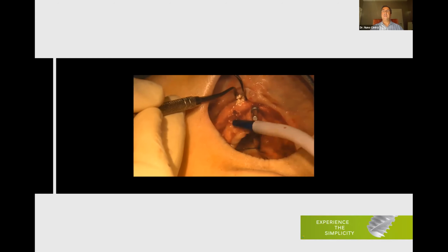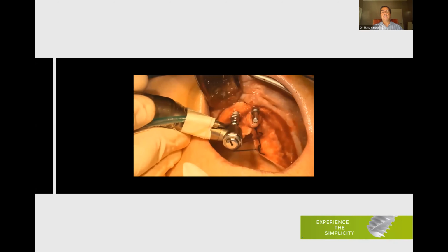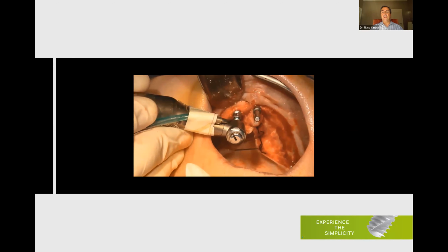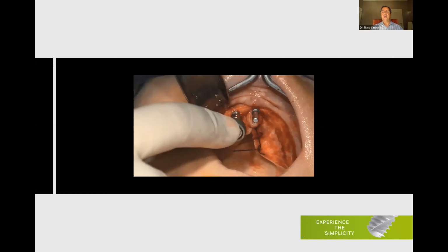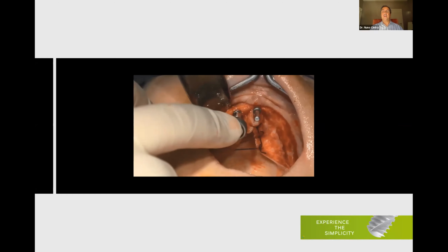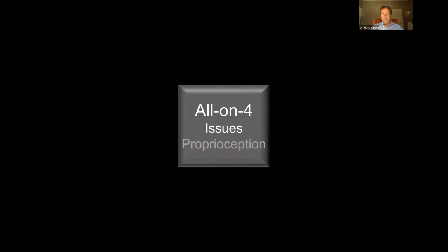Of course, part of this or all of this graft will be resorbed or replaced by bone. And if you can have a small or a thin layer between the tip of the implant and the floor of the nose, it's more than enough. We are talking about we lifted this nasal floor for 4 millimeters. So if at the end of the day we get 2 or 3 millimeters, it's more than enough. So anatomy, in some cases, sometimes you can change it, you can make it better.